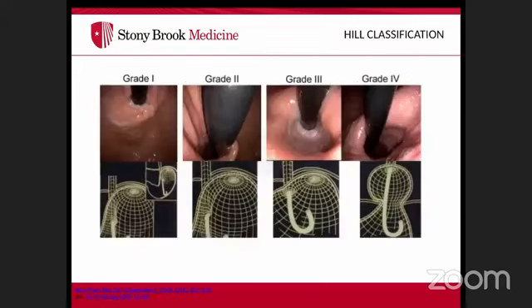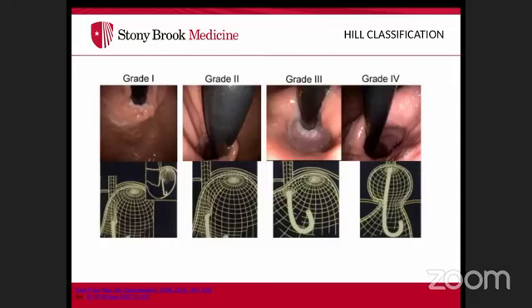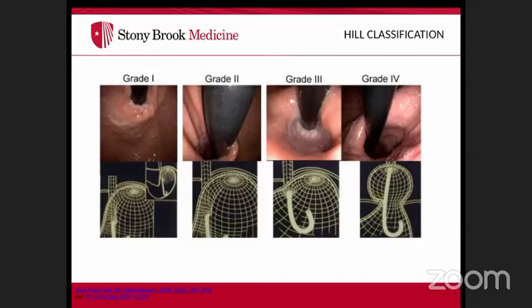Retroflexion also helps identify hiatal hernias using the Hill classification, which grades the gastroesophageal flap valve. A higher Hill grade correlates with greater frequency of reflux, increased prevalence of hiatal hernia, and lower esophageal sphincter pressure. Grade one shows a prominent tight fold around the scope.